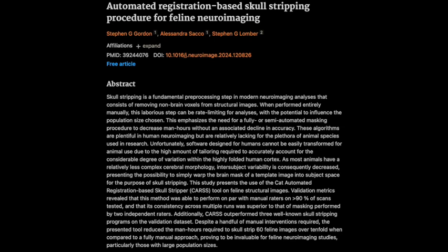It's definitely a possibility. Large tumors or lesions could alter the shape of the brain enough to potentially impact CARS' accuracy. Further research in this area would be valuable to see if the algorithms need any tweaking to handle these types of cases. So testing CARS on a more diverse range of clinical cases could help to refine the tool even further and expand its applicability. Are there any other areas where you see potential for improvement?